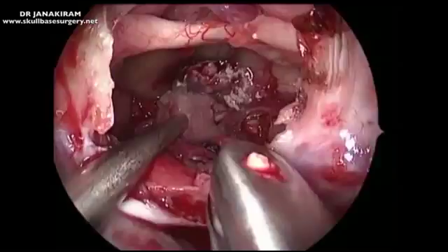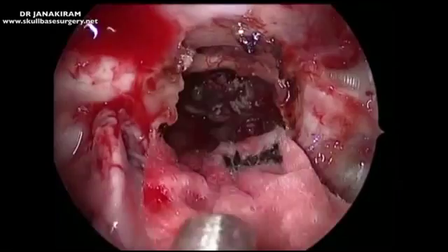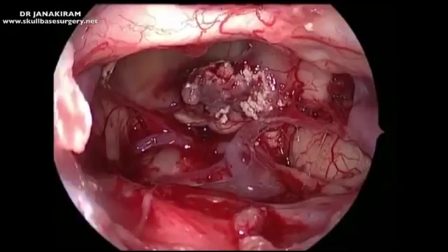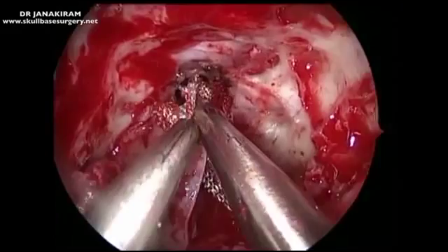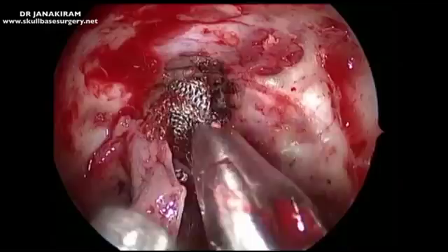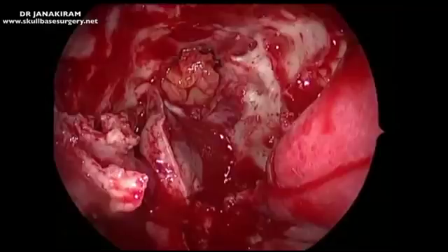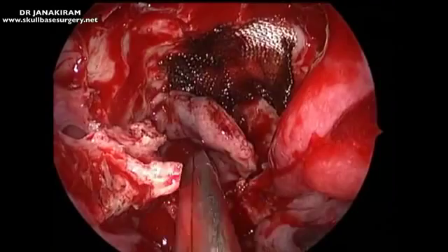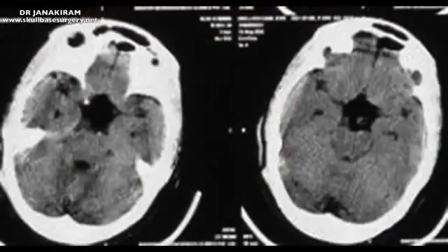The patient did not have any problems post-op and recovered well from the surgery. See how beautifully the interpeduncular fossa is seen. We keep some Surgicel and a little bit of fat there, then we keep the hadad flap. That is about the reconstruction. In our large series of cranios we do not face many problems because our dissection technique is very gentle. We take care to plan the surgery very well beforehand with our radiologist, and the whole surgery is mapped — where we are going to leave it behind. That is fibrin glue being used. That is the post-op — of course a small residue was left behind. Thank you very much.